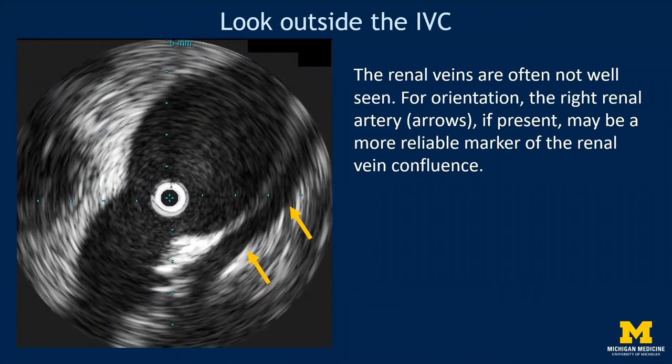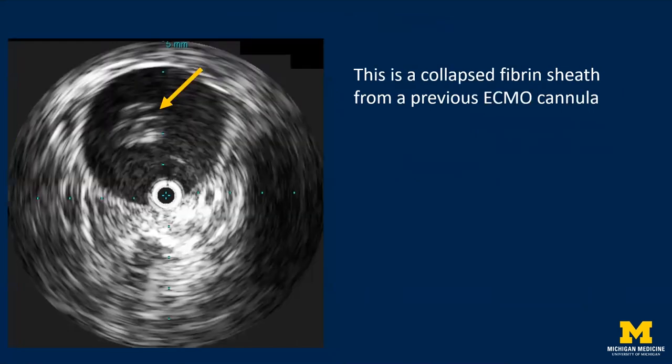As we move caudally, we see the renal vein confluence and, importantly, the right renal artery posterior to the cava. In some patients we may not be able to see the renal vein confluence as clearly, but the right renal artery may be seen even when the renal vein confluence is obscured or difficult to see. When considering placement of an IVC filter, I'll use the right renal artery as a marker to measure where I want to position the apex of the filter — this is a very important landmark. Don't forget to check for intraluminal filling defects, as this may alter your plan. In this patient we see a collapsed fibrin sheath from a previous ECMO cannula, shown here as an echogenic filling defect.